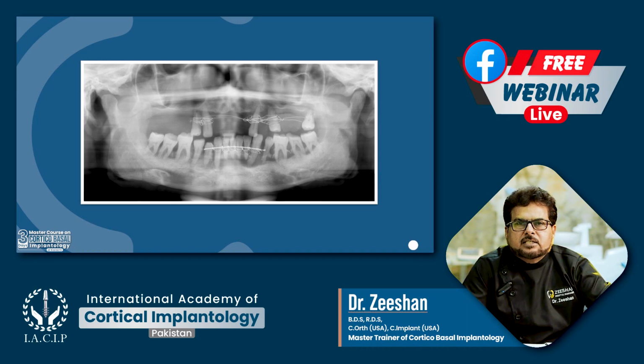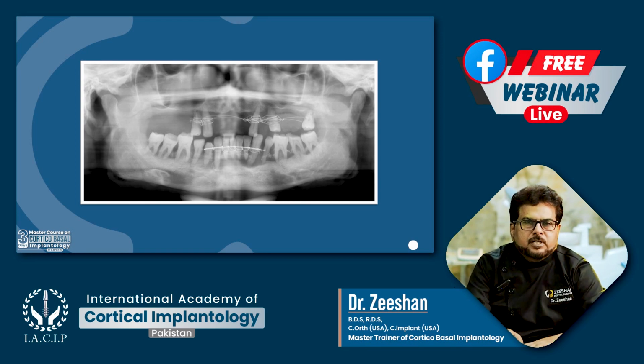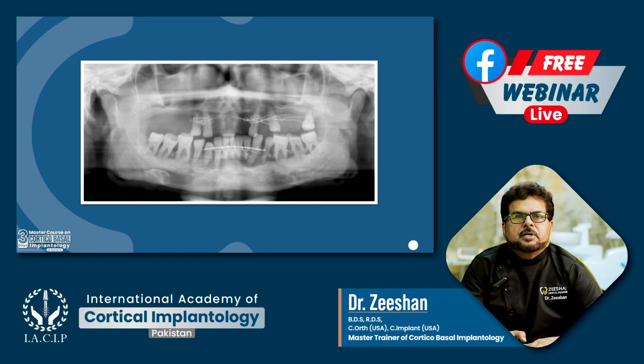So selecting such cases for immediate loading, you need a system of implant which allows you to place the implant and load them immediately. So this is our goal, and which we can achieve with the help of basal implantology or cortical implantology. So gaining the primary stability is the prime concept for immediate loading.